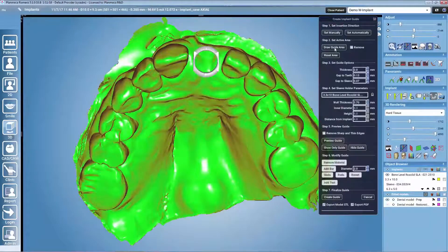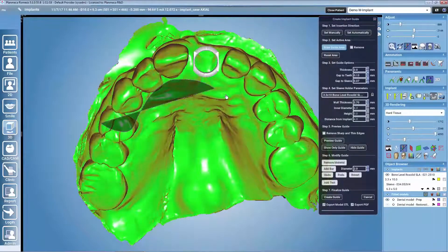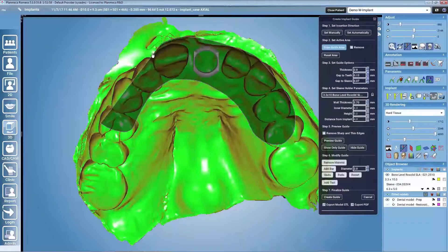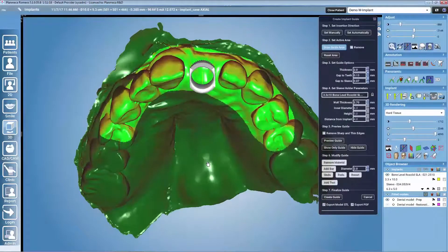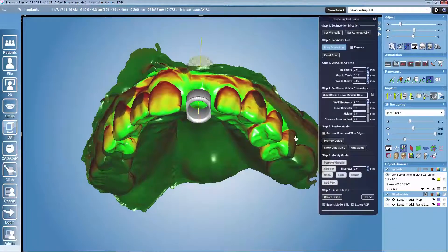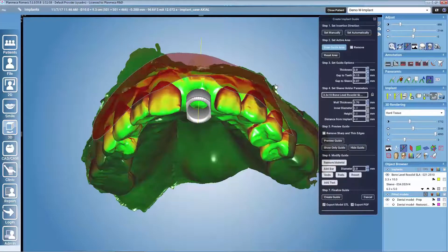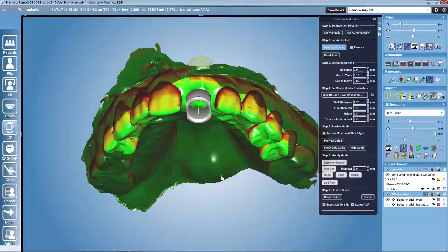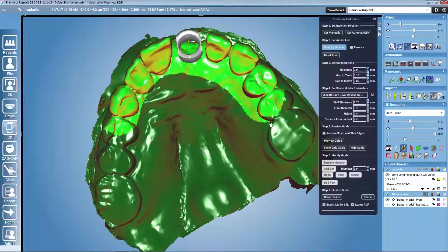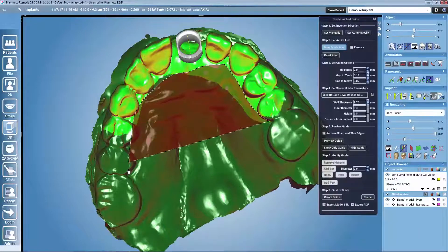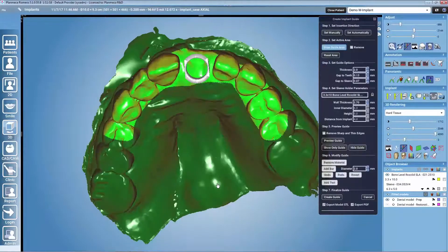The second step is to draw the guide area. With mouse left click we select the area that we want to create the guide onto, and with mouse right click we can remove areas. So mouse left click adds, mouse right click removes. With the mouse wheel you can rotate the model, and if you don't have a mouse wheel you can also use the Alt button combined with left click.